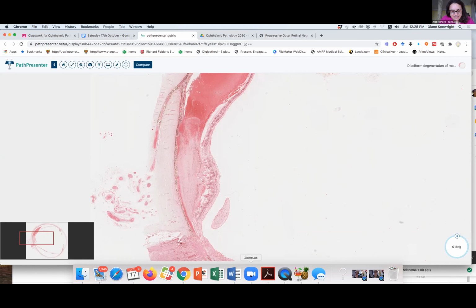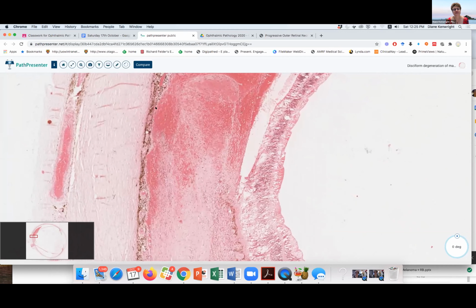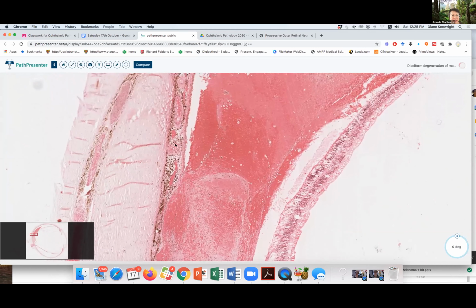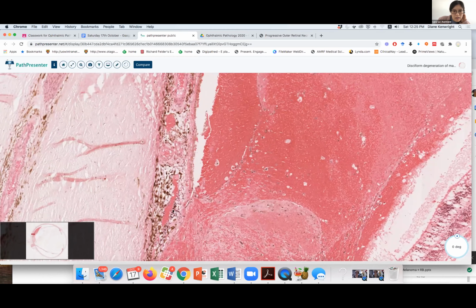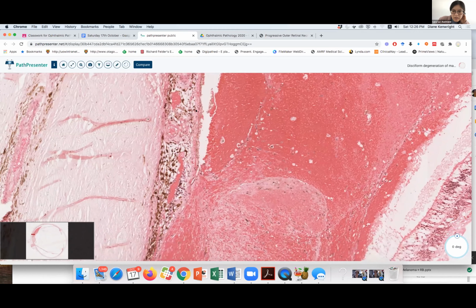Yeah, I would presume this is a result of end stage wet age-related macular degeneration. So they would have developed a choroidal neovascular membrane which would have bled and caused subretinal and intraretinal fluid. And then that membrane eventually formed a fibrous disciform scar. Too much vascular proliferation of the choroid here? So Lucy's given us a plausible pathogenesis. And clinically we call it the type 1 choroidal neovascular membrane, because most of it's under the RPE.